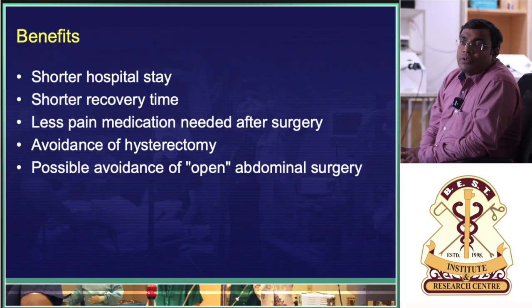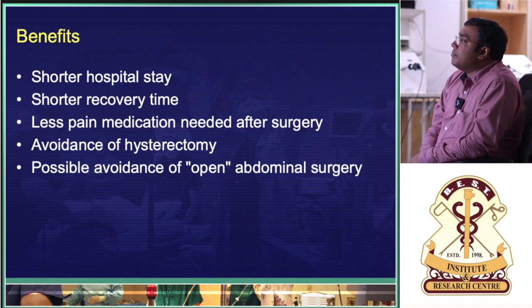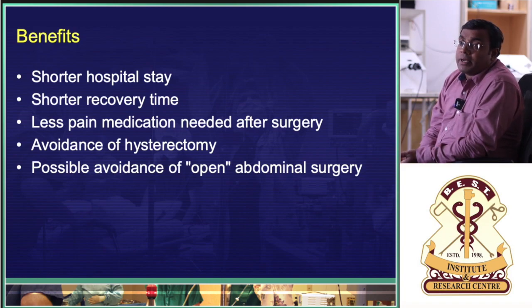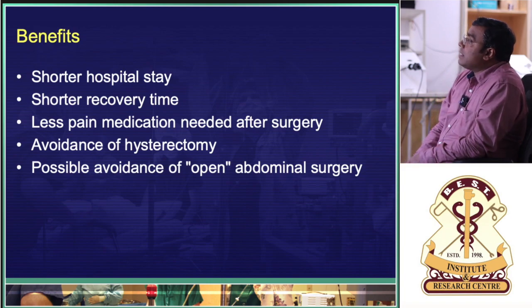Advantages, all of you know: short hospital stay, easy learning curve, faster recovery, pain is absolutely very minimal, you can avoid a hysterectomy, but the exact pathology can be found out, early stage malignancy can be picked up, or pre-malignant lesions.